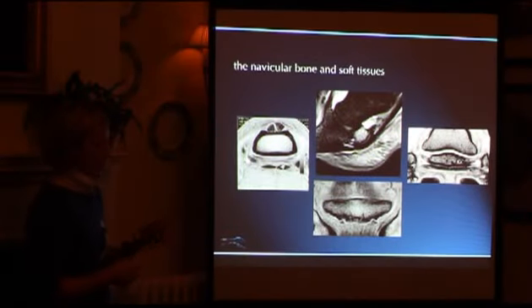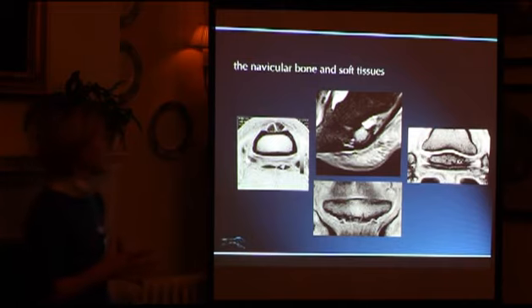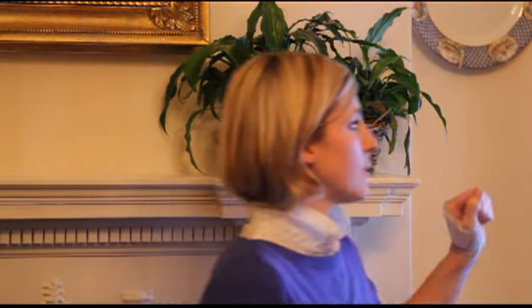So we're going to talk a little bit about some of the types of pathologies that we see and the types of conditions that you will no doubt read about on reports that are coming through to you, just so that we can visualise it when we see it written in words. But we're all familiar with most of the types of pathologies that we see on this slide here.